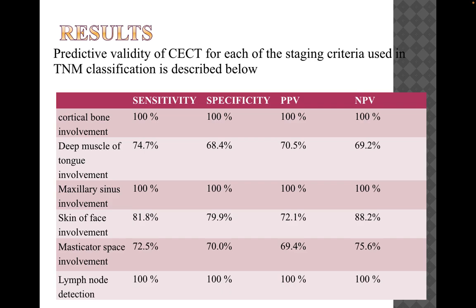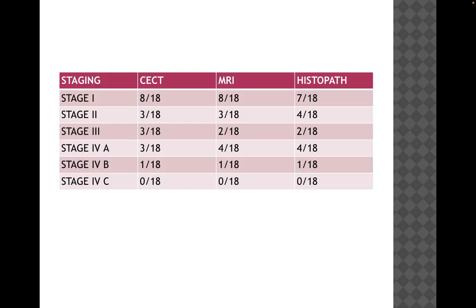The validity of CECT for each of the staging criteria used in the TNM classification is described in the next slides. If we compare CECT, MRI and histopathological report, MRI is the better modality.